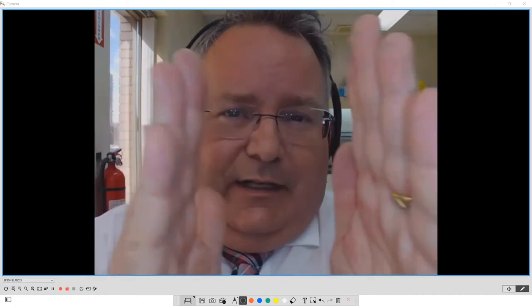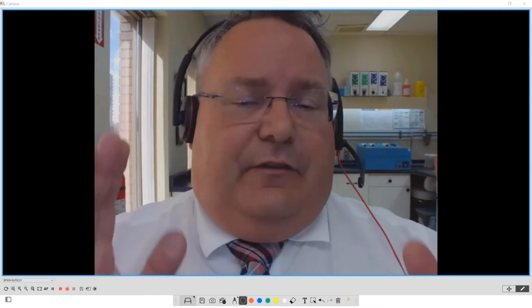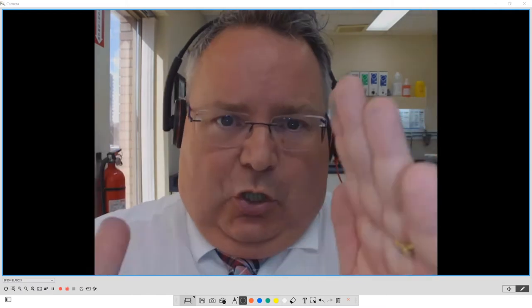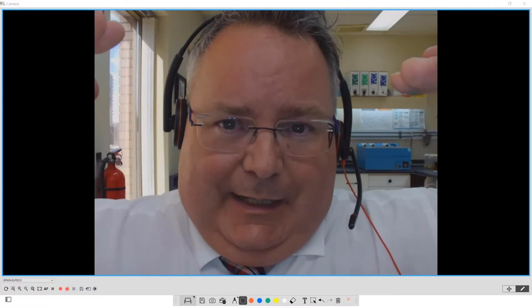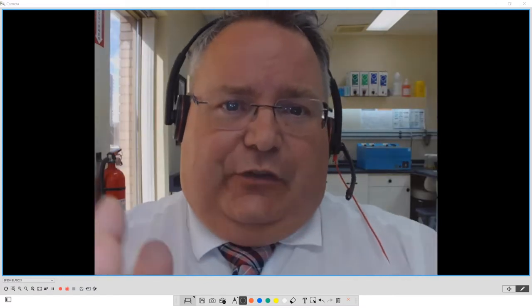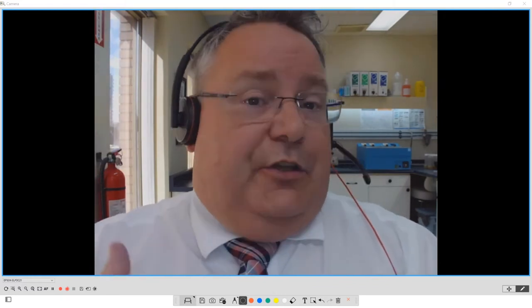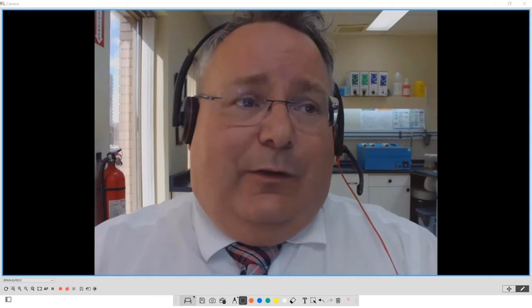Now it's a chew cycle. It's got to operate in that chew cycle without a hit, and slide into position, conventional or digital. It's got to go in. So you've got to watch the guiding planes, open the guiding planes up as required. Everyone has a chew cycle. How to identify that chew cycle? Days of the week, months of the year. Or you can actually have them chew and watch it.